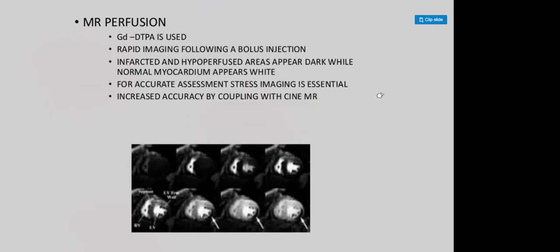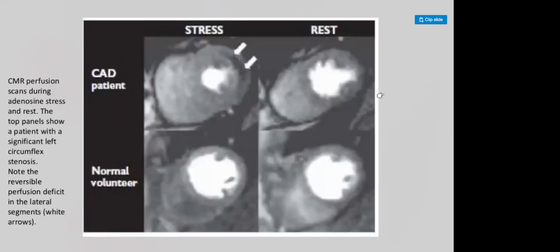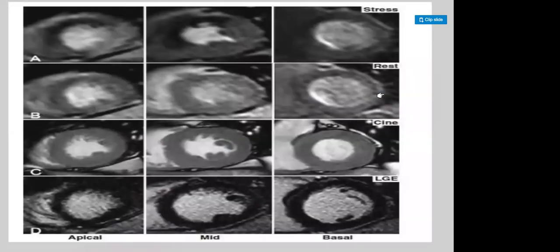Seeing is believing, isn't it? So let's try to show you some of those, how they look. For example, the below images refer to a person with normal findings, okay? However, the ones on top are patients with coronary artery disease. So in the different segments which we can see, initially, when we are trying to do the myocardial perfusion, it appears pretty normal, right?